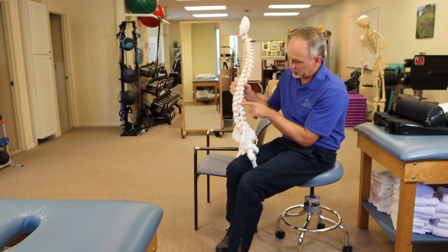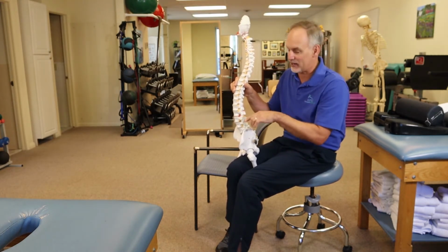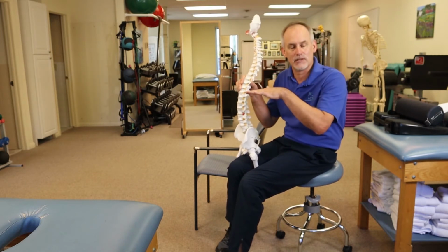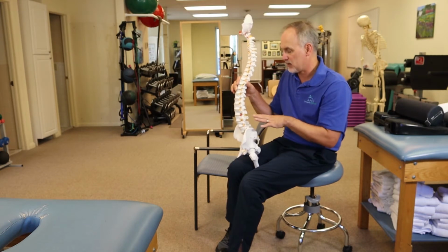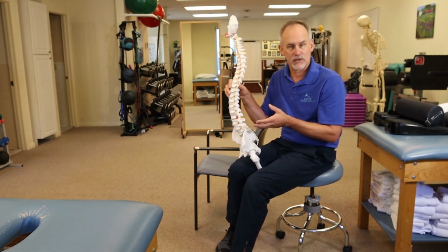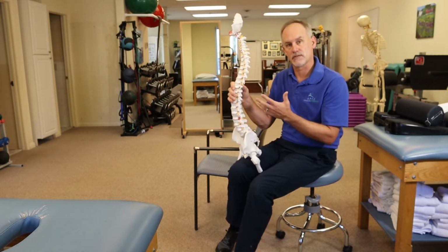We're trying to keep that back kind of in an alignment here. If you look at the vertebrae here, they're kind of stacked, and we're trying to keep everything nice and evenly stacked. You have the little disc segments in between here, and we're just trying to stack everything evenly. And by doing that, and by maintaining this curve, hopefully we heal a little faster, okay? So that's one of the things we want to consider. And the lumbar roll is what achieves this.